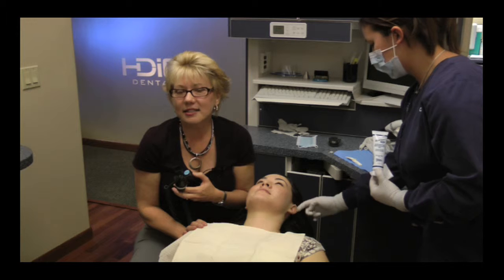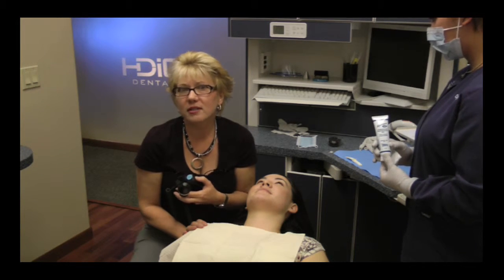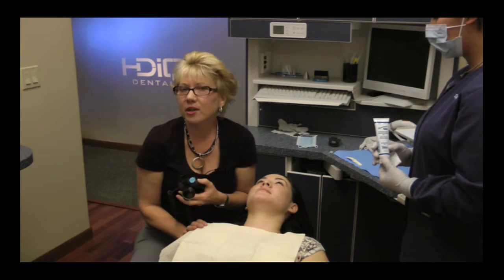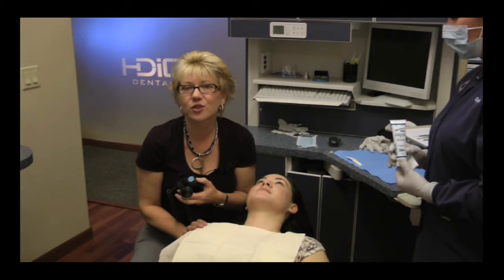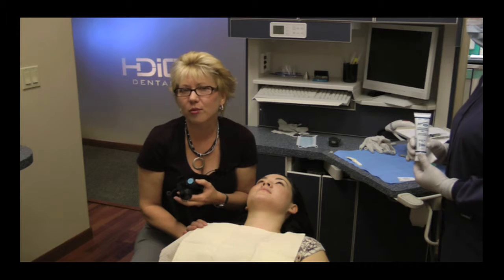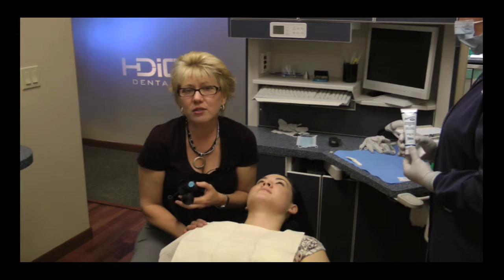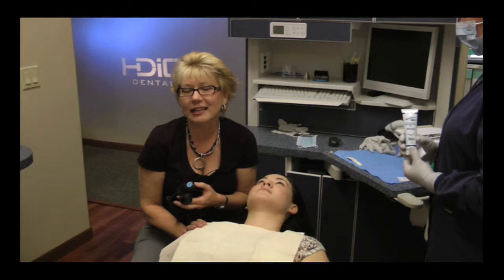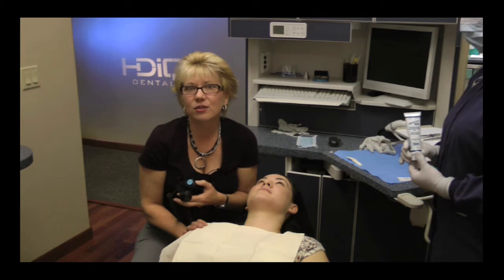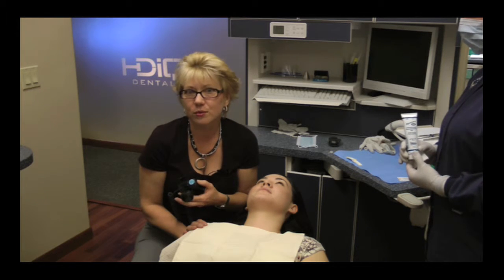And I want to try to isolate some different things when I do this. We talked in the other piece about joint diagnosis, how important it is to understand where we hear the joint noise. Is it on rotation, telling me there's something going on with the medial aspect of the disc, or is it on translation, telling me it's a lateral aspect of the disc? Those are two totally different patients. They have different risks from a restorative perspective, and they have different futures and outcomes from a standpoint of treating their joints and getting them asymptomatic. So that's going to be important. How I'm going to do that is I'm going to ask Katie to do some very specific movements for me so that I can isolate those sounds.